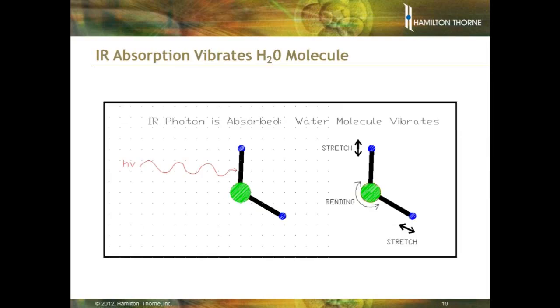Now, the way that this light works is that the photon of light is absorbed directly by the water molecule. And the reason I'm emphasizing this is because it's slightly different than what some other lasers do. It's absorbed by the water and makes the water get very hot. The water has an oxygen and hydrogen, and they're connected by sort of strings.